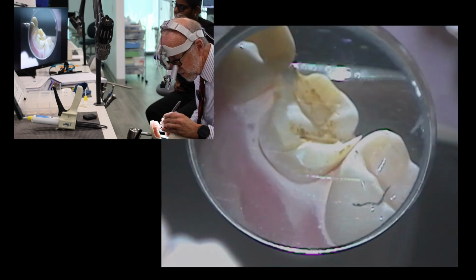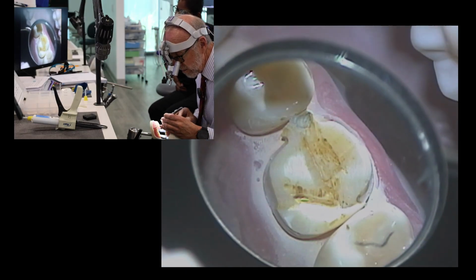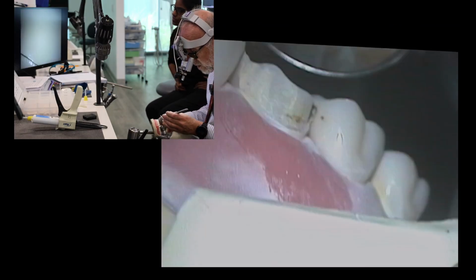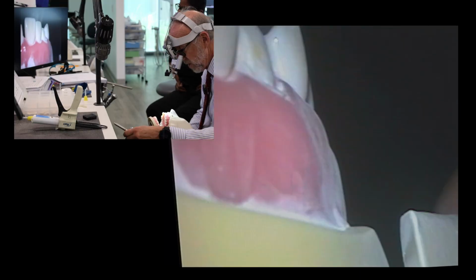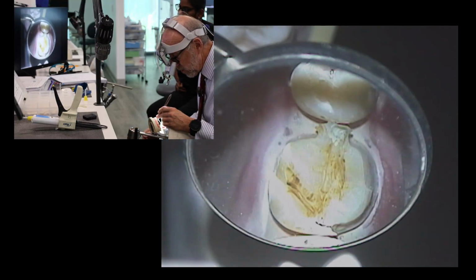Keep the margin near the gingiva all the time. Keep the end of the burr at the margin all the time. And then finish the other surfaces there. Match up the distal side to the mesial side that I did. And then we'll work on another prep.